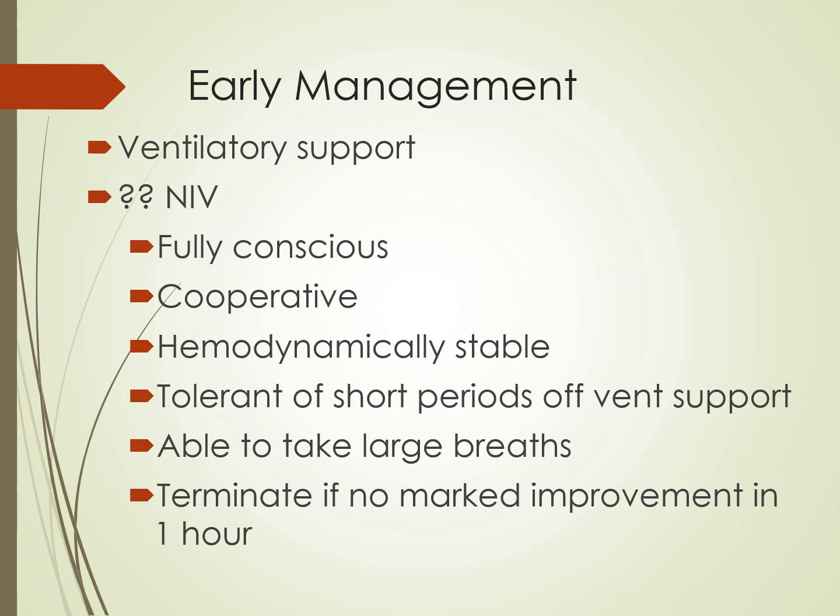If you put someone on non-invasive ventilation and you don't see any improvement in their PF ratio, say I'm talking about a PF ratio of 200, 225, and you put them on for 1 hour and they don't do better with the non-invasive ventilation, that's the time to intubate. Many studies have shown that if you keep someone on non-invasive ventilation for a prolonged period of time, this can cause further damage to the patient and actually increase the mortality.